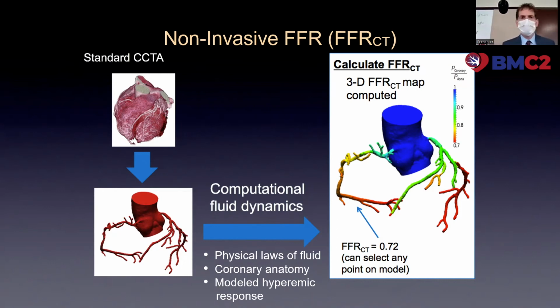What fractional flow reserve CT does is you basically take the standard CT data set, send it to a company in California that then does three-dimensional modeling and computational flow hemodynamics to estimate, is that lesion causing stenosis, causing decreased blood flow during that artery or not?